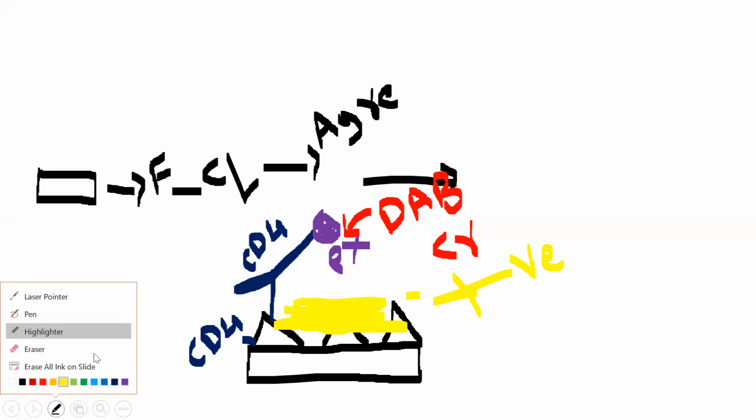So here there is involvement of three important things. One is antibodies, second one is conjugates that will bind to the antibody, and third one is coloring agents such as DAB, diaminobenzidine. Okay, these are the three components in the staining part of immunohistochemistry. But there are two problems. So I'm going to write the two problems.